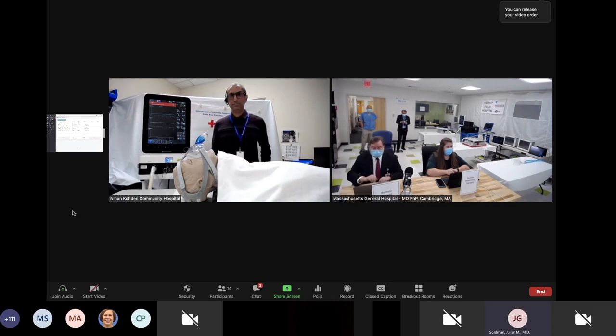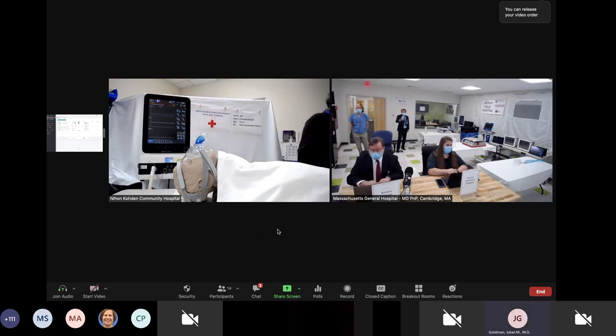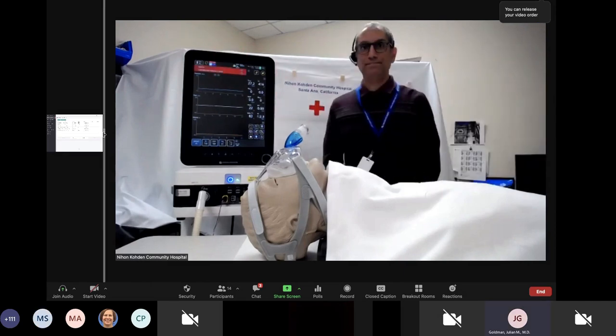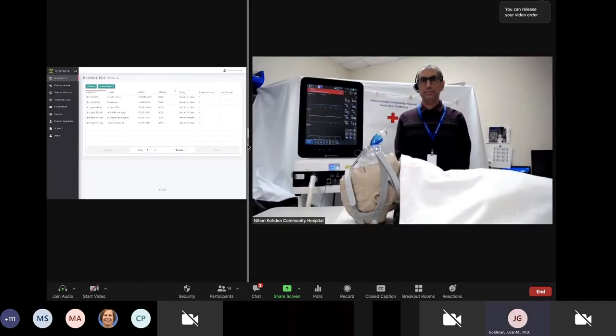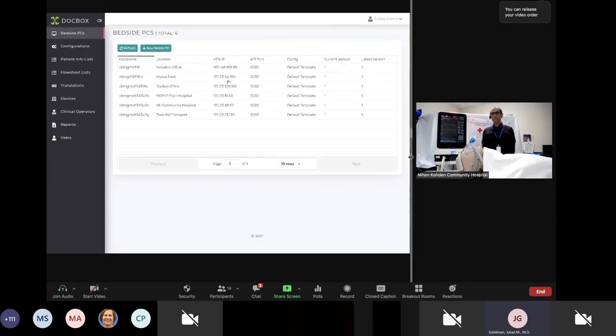Miran, sorry to hear that. I'm happy to say that we're available. I'm here, and next to me is a respiratory therapist, Alyssa. If you press the button that allows us remote access to your ventilator, we'll take a look at the data and see how we might be able to help. I will do that right away. All right. Done. Thank you. Well, let's see. We have to now connect to your ventilator. So let's navigate through our user interface.